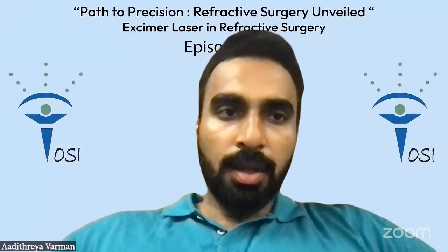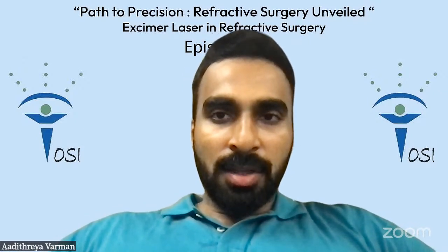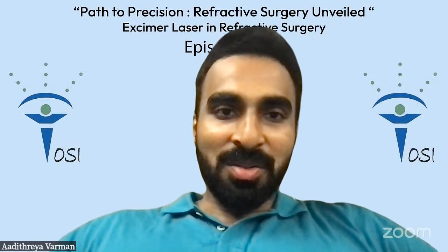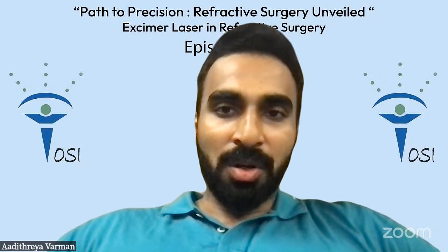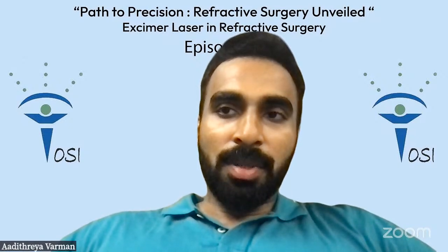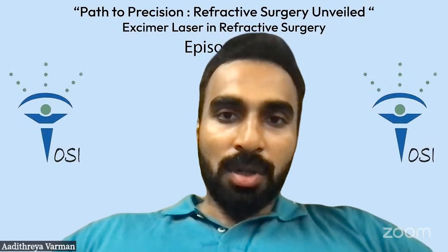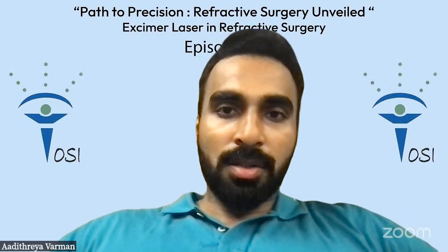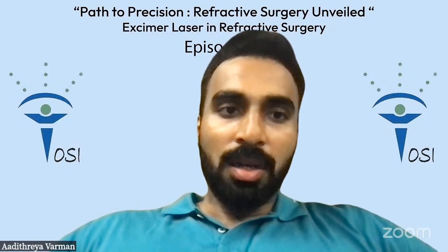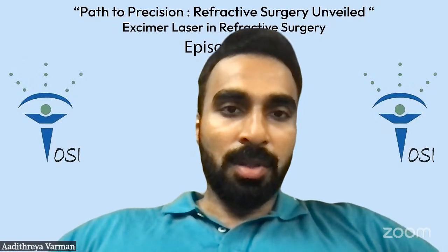The other thing I also tell my patients who are going to undergo PRK is that they might see 6/6 in 2 weeks, but it might not be a very crisp 6/6. So I think it's important to put this point across preoperatively. Even though they might see 6/6, the epithelium is not that regular yet at the end of 2 weeks, it takes its own time. The sharpness, the contrast sensitivity, everything can take even up to 2 or 3 months for them to achieve the full contrast and sharpness that they might want to achieve with the laser. So I think that's something to keep in mind.